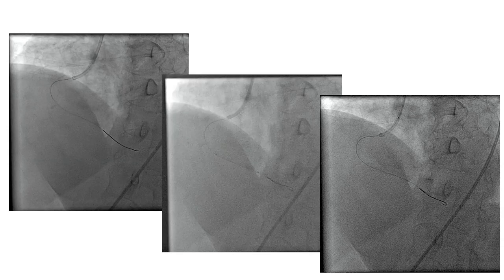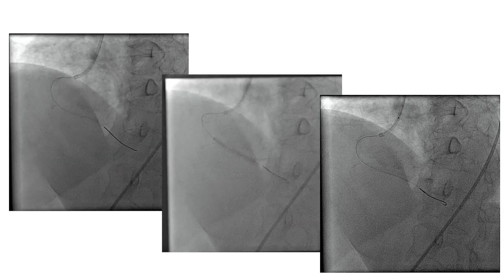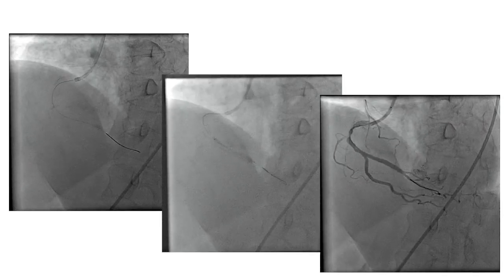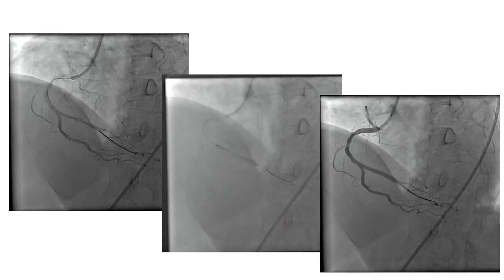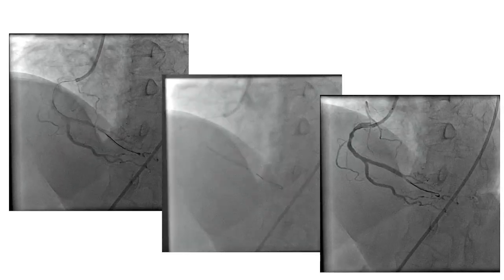We took a 2.75 into 20 millimeter stent, as we had no 2.5 millimeter stent at that time in our hand. And you can see after the stent balloon inflation, there is some leaking jet in the distal part of the stent.